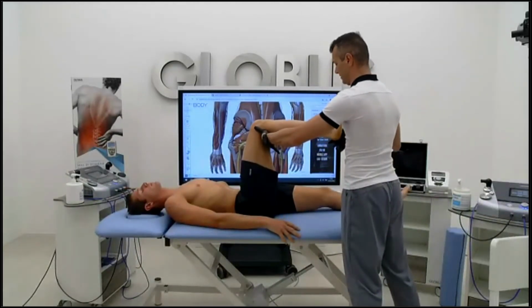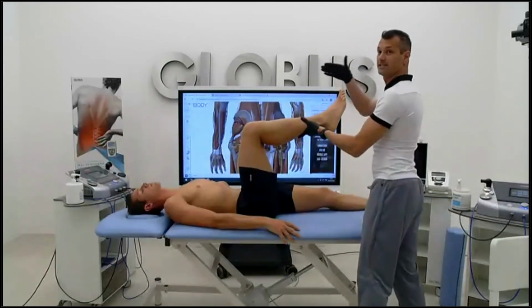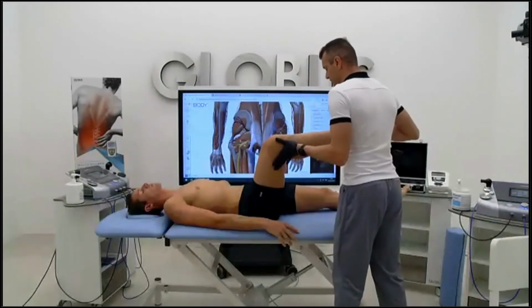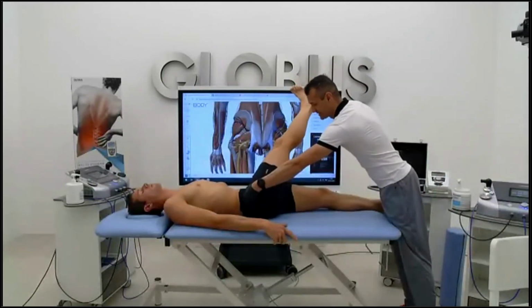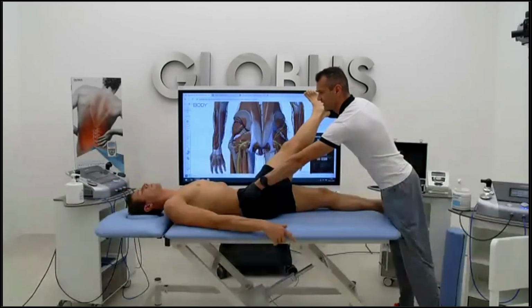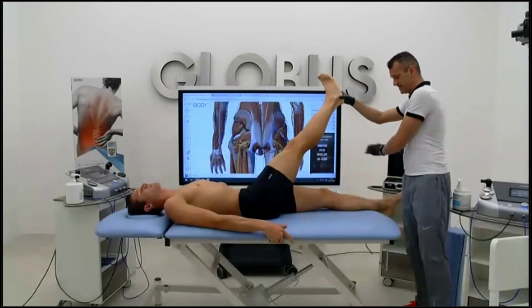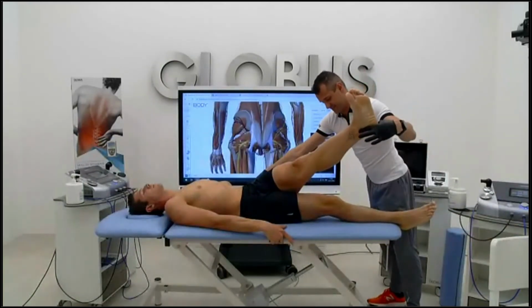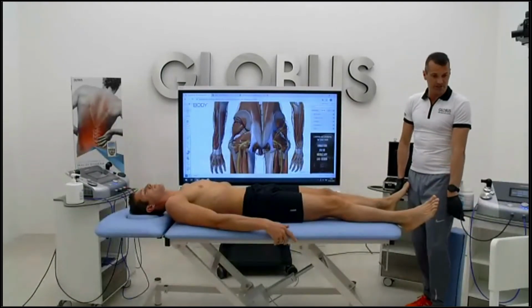Well, we achieved 15 degrees more. Maybe you cannot see here because we need this kind of view, but we increased the internal rotation, have a look. Wow. Now if we fix the hip at 60 degrees, lo senti che è diverso? No. All right, now we're crossing the other leg, so maybe we need to do a bit more on the other one now. Oh, they are similar. It's okay, they are similar. Okay, Diego, any questions, any ideas?